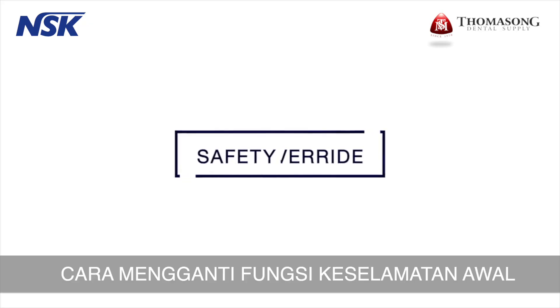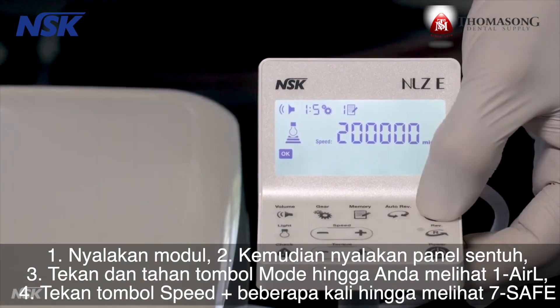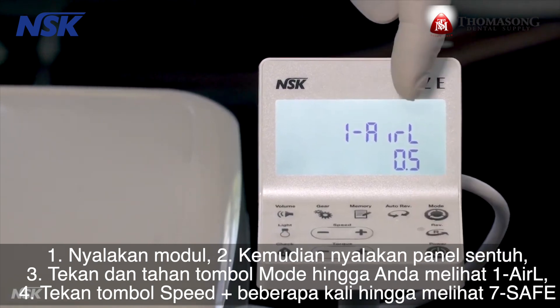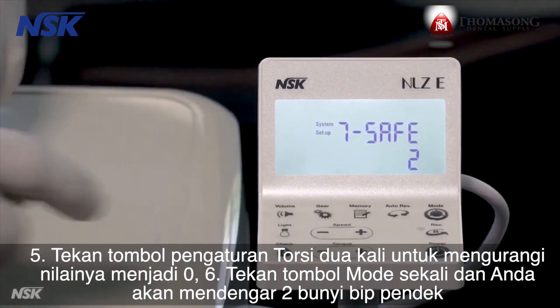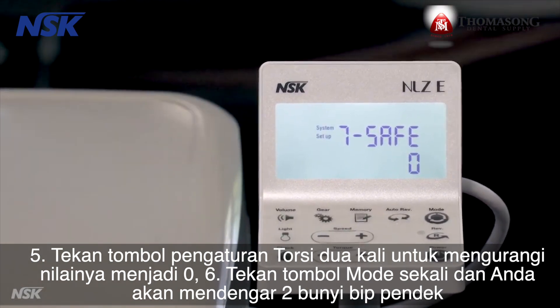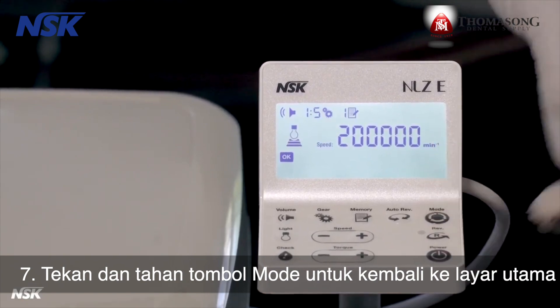To override the initial safety functions: turn on the module, then turn on the touch panel. Press and hold the mode button until you see 1-ARL. Press the speed plus button several times until you see 7-SAFE. Press the torque setting button two times to reduce the value to zero. Press the mode button once and you will hear two short beeps. Press and hold the mode button to go back to the main screen.